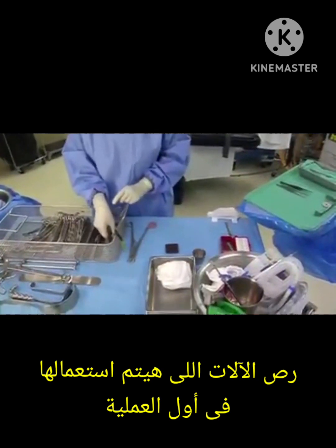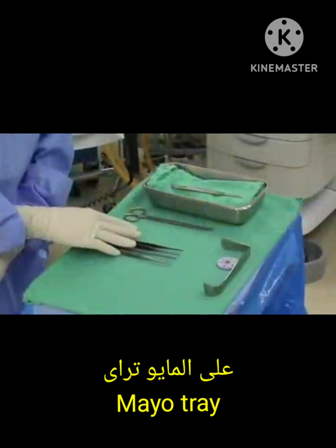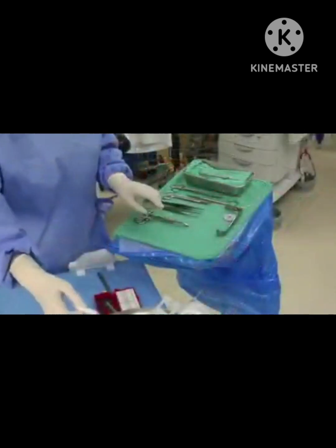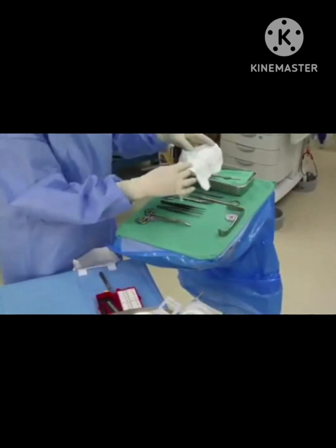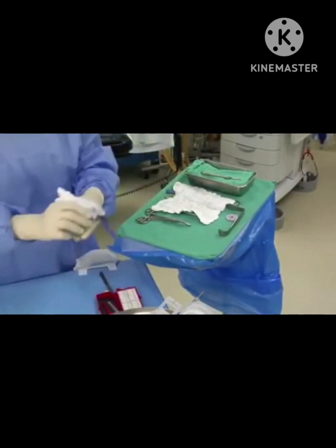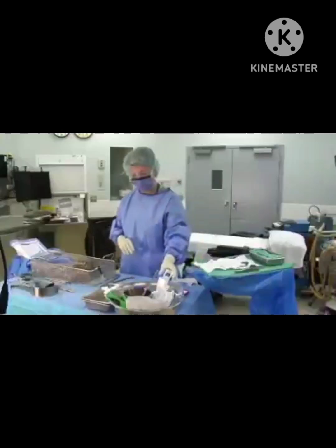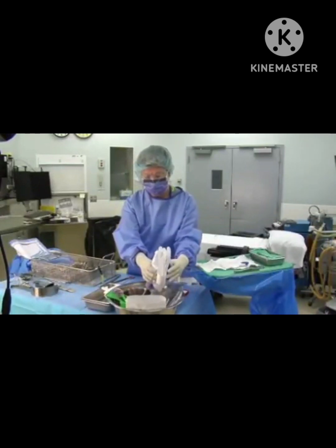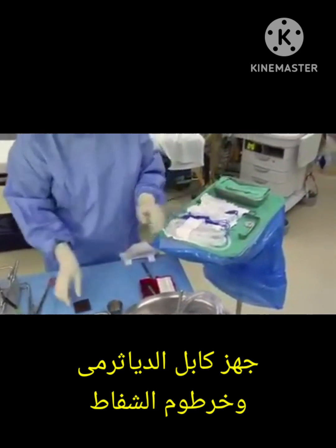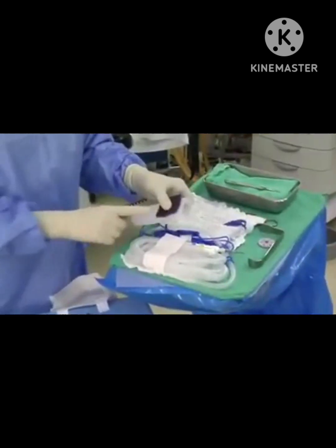Select and place the instruments and equipment required for the initial stages of surgery onto the mayo tray. Prepare the tray as soon as possible after completing the count. Once you have assembled the instruments, place two lap sponges over the instruments, tucking the tags in to avoid tangling. Do not cover the neutral zone basin or area — sharp items must always be visible to team members to avoid accidental injury. Place the assembled ESU and smoke evacuator tubing on top.